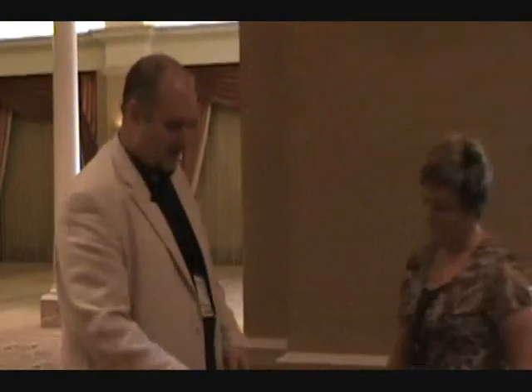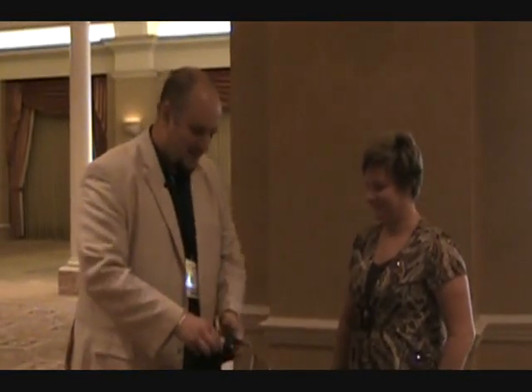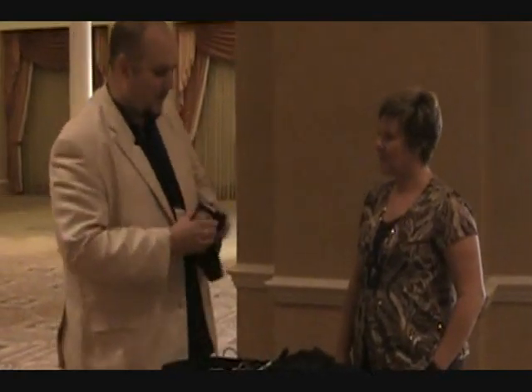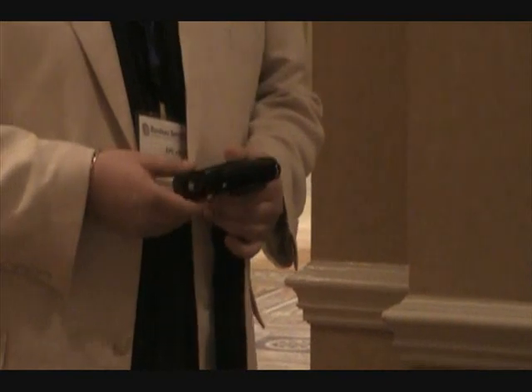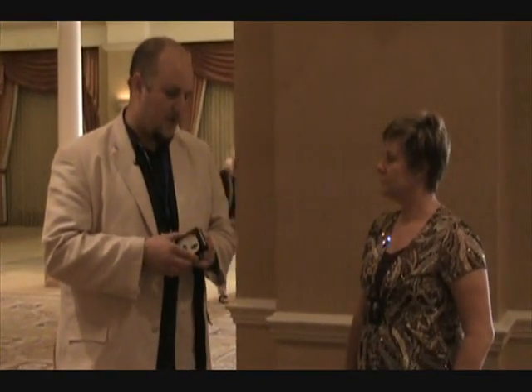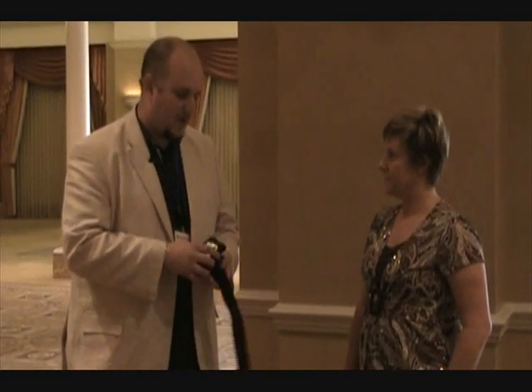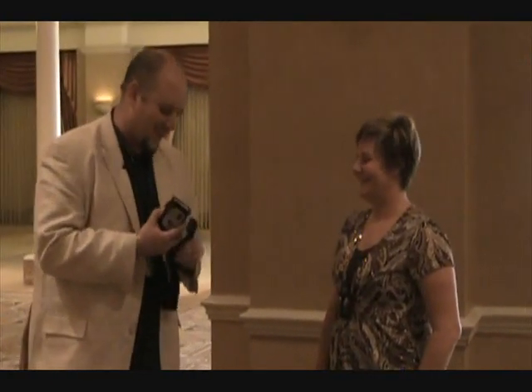I have Dr. Goodwill here who's going to be our model tonight. The only thing that's been done so far on the device is that we've programmed the patient's name, put in some basic demographic info, and told it when it's going to turn on and off. Tonight it's going to turn on at midnight and turn off about six hours later, so we'll have a good six-hour chunk of time. We're in Vegas, so try to be in bed around midnight as best you can.